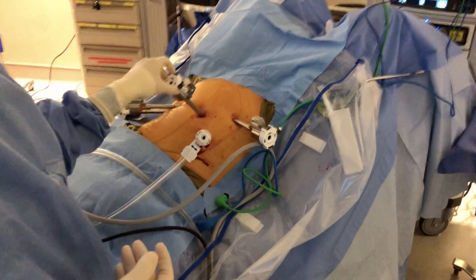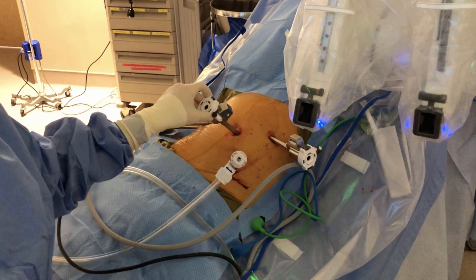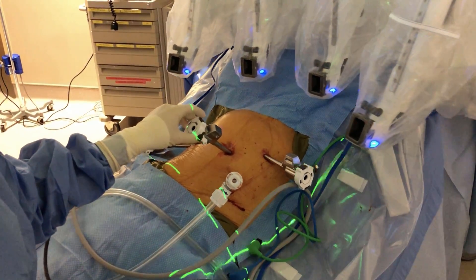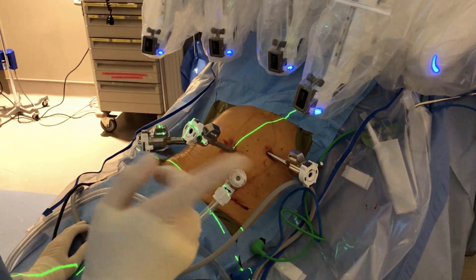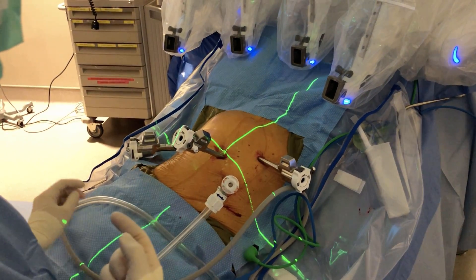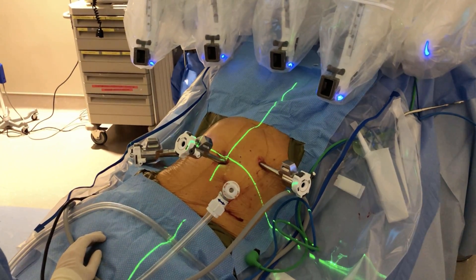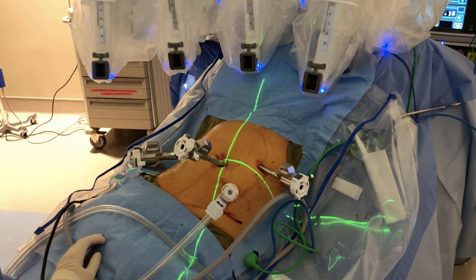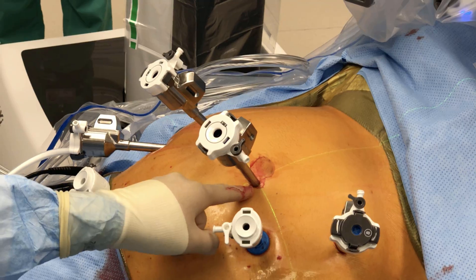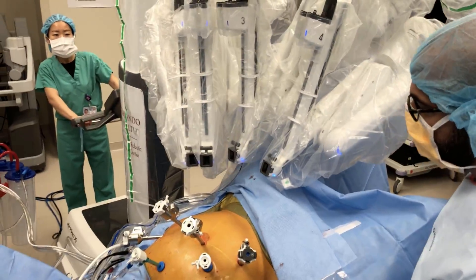The process begins by placing the patient in a Trendelenburg position, left side up, and bringing the robot in with the crosshairs pointed right at the camera port as usual. Then either the person driving the robot can rotate the boom manually so the laser lines up in a parallel configuration with the trajectory of the ports, or you can do it yourself by manually grabbing the boom. Behind arms number one and four there's a clutch button that you can press and then rotate the upper portion of the boom to line up the laser in that parallel configuration.